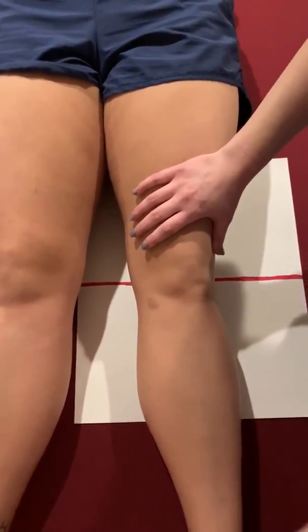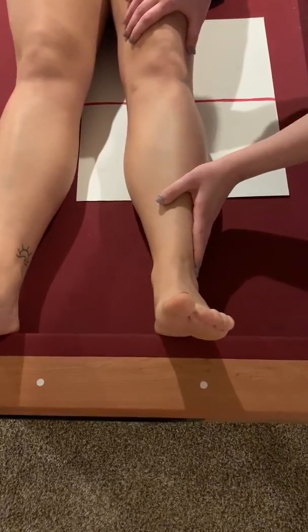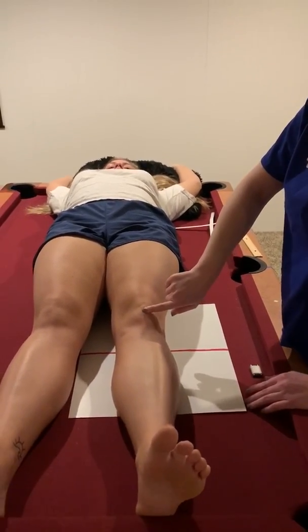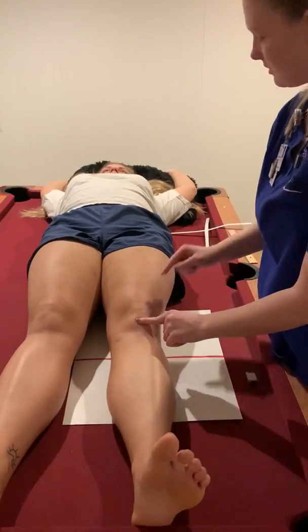But first I'm going to make sure that her feet are pointed up towards the ceiling and that her legs are straight. Then I'm going to locate the patella, which is right here, and the apex, and go a half inch distal from that. So that's where I would center this way.